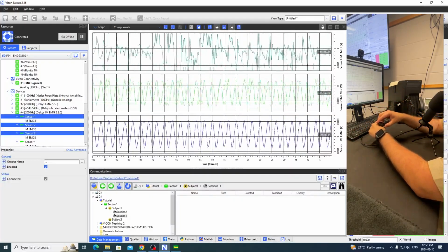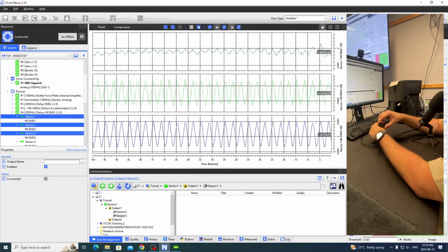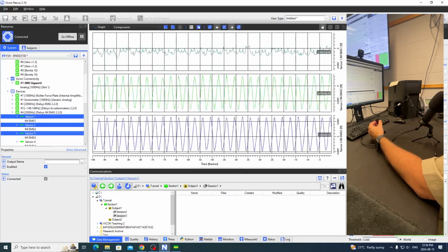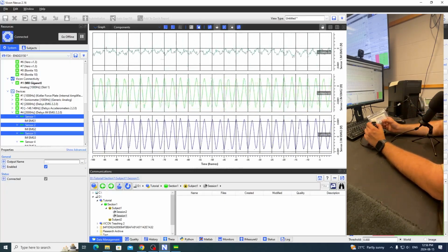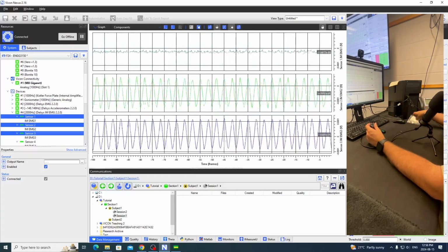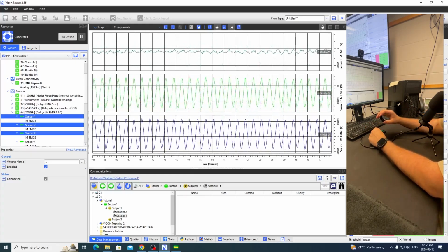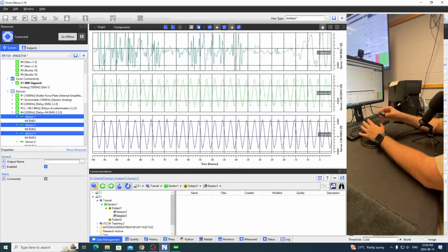You should put this on the muscle of interest. So you should put the adhesives. There will be adhesives in the charging station in the right compartments. So grab an adhesive, put it to the back, and then follow the EMG muscle placement procedure. But for the time being, I'm going to put it on my hand just to demonstrate that we're getting data.